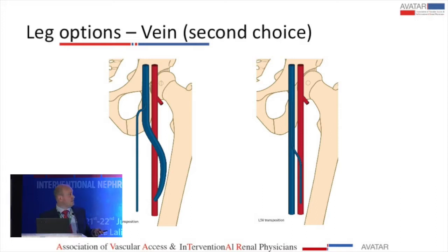Now, this femoral vein transposition has been running for 7 years now, but it's required some work. This is an inflow reduction. We had to band it because it was running at about 6 liters per minute. And then it developed a stenosis where we banded it, of course. So we've been angioplastying that. The other thing is, presumably because of the huge shear force in it, the iliac vein occluded above it. And we angioplastied it a few times. And if you can see that, there's now a stent. We've had to stent that open to keep it open.